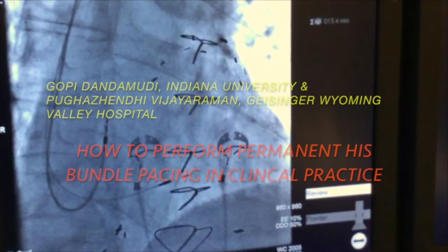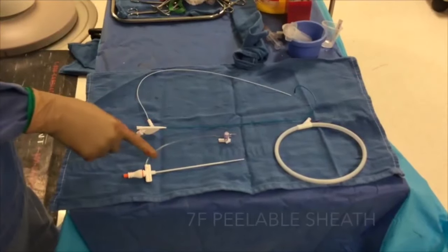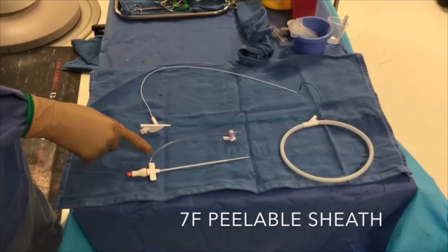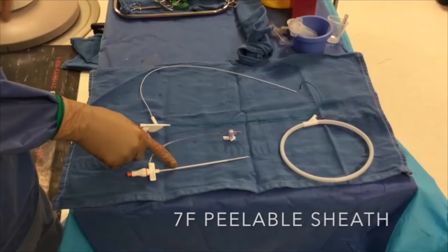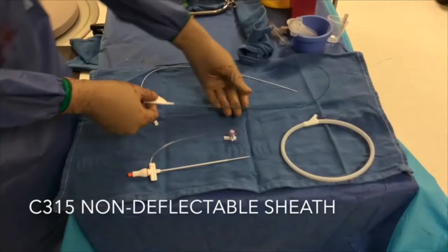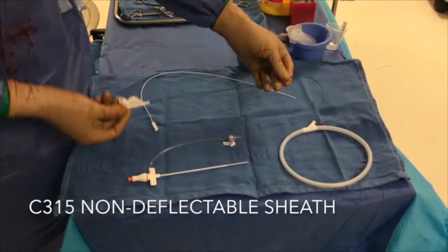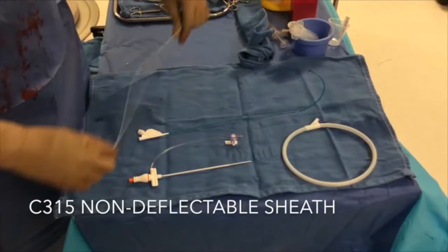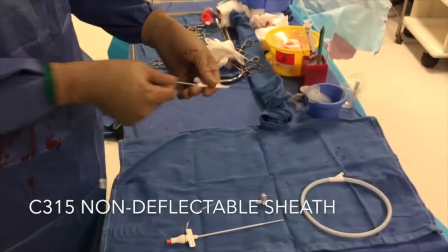Basic equipment needed for the procedure include a 7-French peelable sheath or a retaining wire in case access is required after the his sheath is split. The C315 his sheath, which has two curves, a primary curve which helps reach the annulus and a secondary curve that helps reach the septum, and a dilator that goes through the sheath to straighten it out as it is introduced into the vascular space, and finally a J-wire that is introduced through the dilator to help place the tip of the sheath in the right atrium or right ventricle.